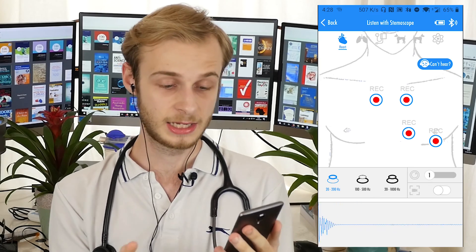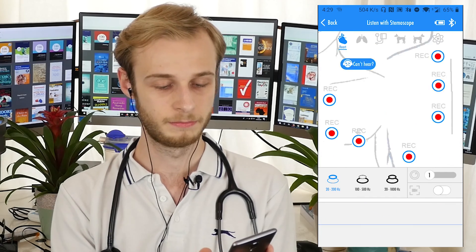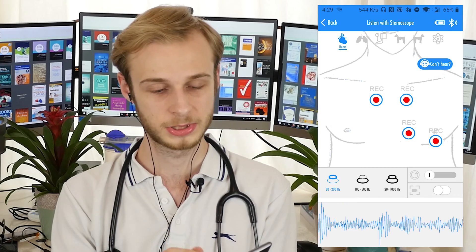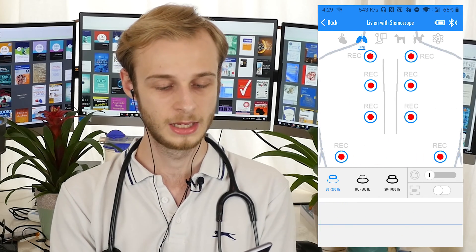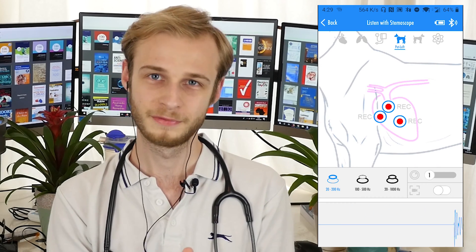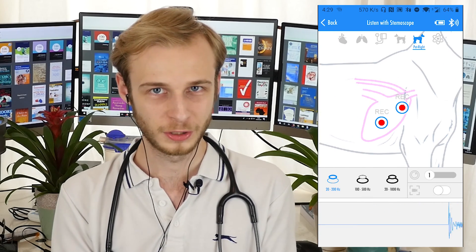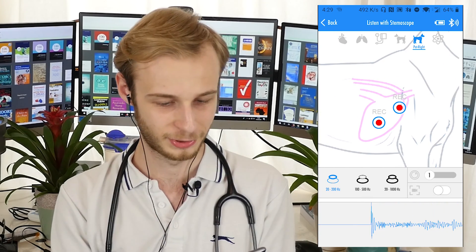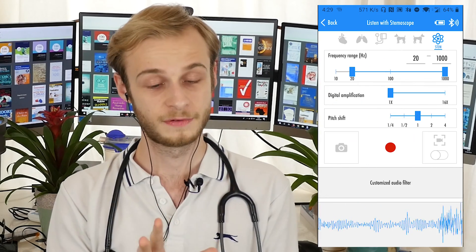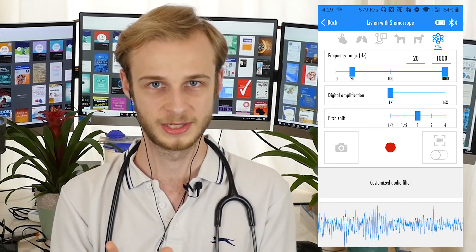Before we do any listening, I'm just going to take you through what we have in the app. Looking at the top, there are a few different modes we can choose from. The first one is a heart mode, giving us the positions where you would auscultate the four heart valves. We've then got a mode for lungs, one for doing a manual blood pressure — which I think is a really nice touch — then one for pets. I can't imagine any of my pets sitting still long enough to tolerate me prodding them with a stethoscope, but good luck. And then we have a final mode where you can more closely tailor the response to exactly what you want, but we'll focus on that another time.